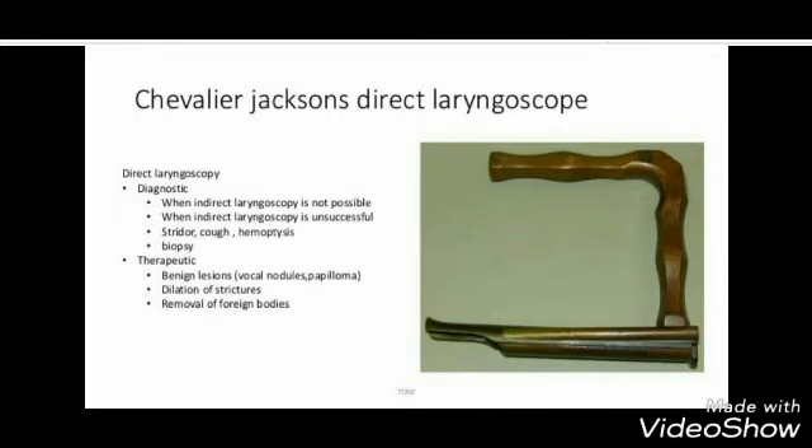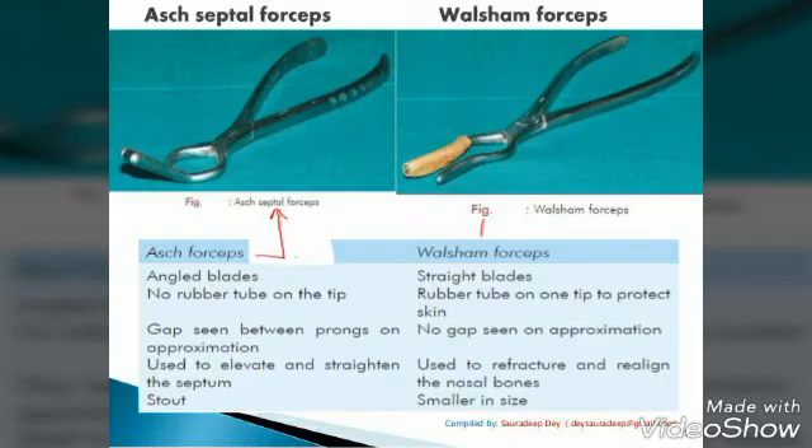It is the Chevalier Jackson direct laryngoscope. It has diagnostic and therapeutic uses, including management of stridor, cough, hemoptysis, and removal of foreign body.